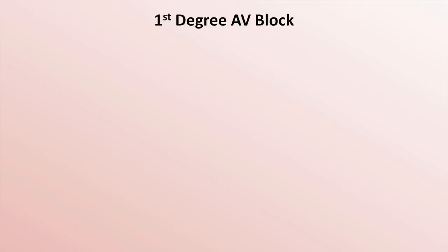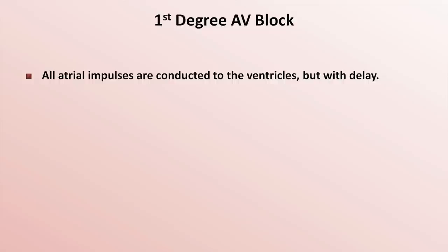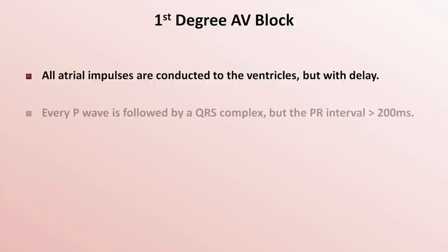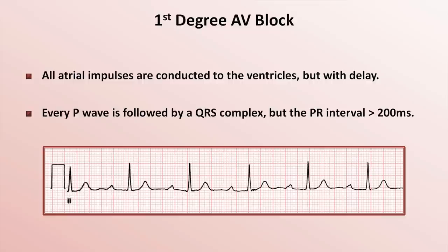The simplest form is first degree block. In first degree block, all atrial impulses are conducted to the ventricles but with delay. Therefore, every P wave is followed by a QRS complex, but the PR interval is greater than the normal 200 milliseconds. Here's an example of first degree block. Notice the one-to-one correlation between P waves and QRS complexes — every P wave gets conducted and the PR interval is constant. However, that constant PR interval is prolonged; in this case, it's about 320 milliseconds.